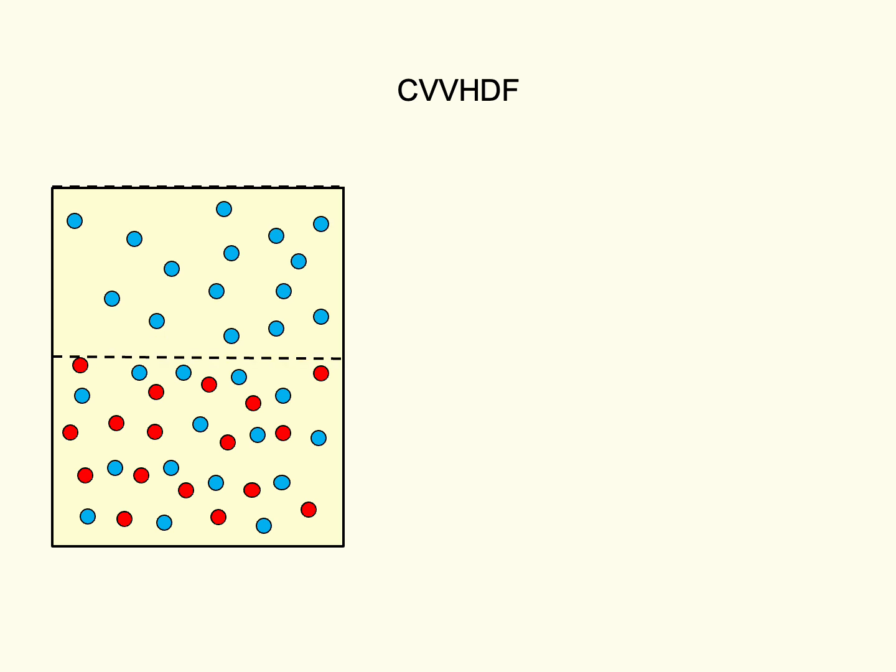Next, let's look at continuous veno-venous hemodiafiltration, or CVVH-DF. Here, hemofiltration occurs just as we described for CVVH, but the hemofilter capillaries also have dialysate flowing by, which allows extra molecules of toxic stuff to sneak across the capillary membranes at each pass.